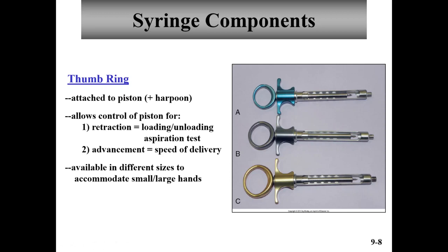But be aware that you can get different size thumb rings, which will make it easier to control the piston when you get out in practice.